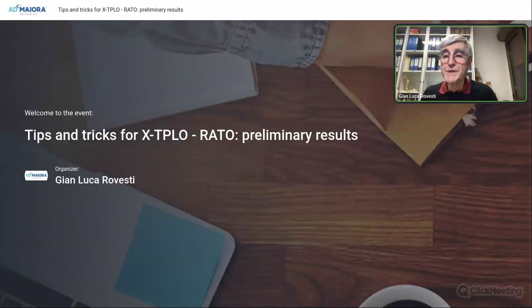The jigsaw was used in clinical patients as well, not only, but of course, I had a hard work beforehand on cadavers to check the technique, because as I mentioned before, I made a lot of mistakes and unsuccessful attempts before finding what now I think is the most predictable way to perform this osteotomy on the desired plane, okay? Without the risk, there is not a technical issue to perform the osteotomy with the oscillating saw.